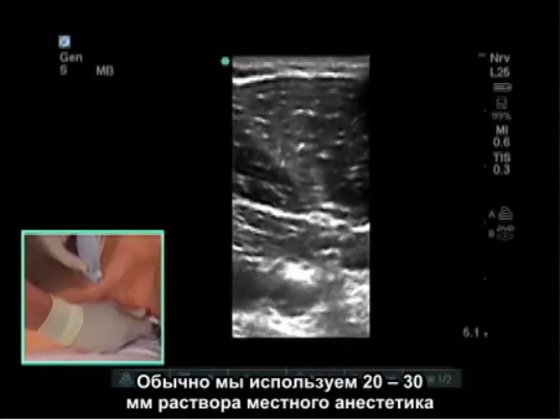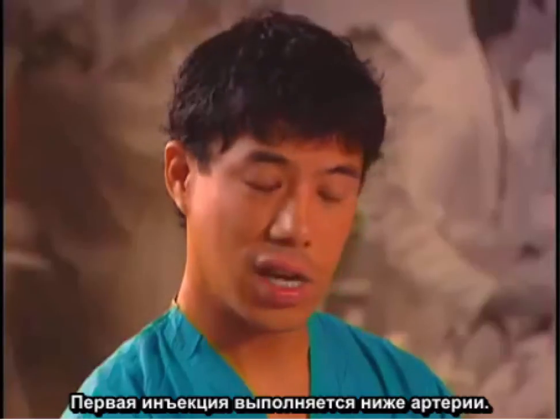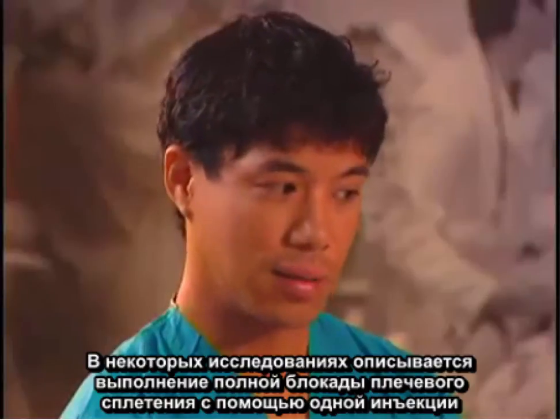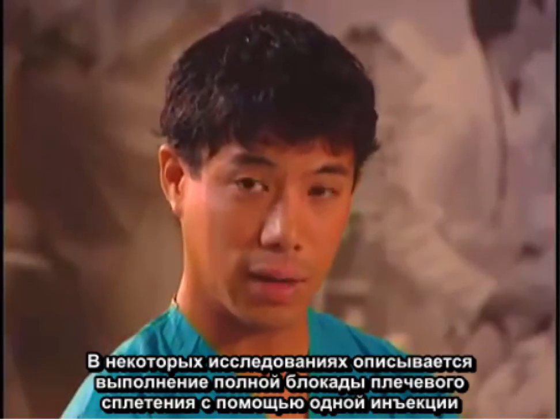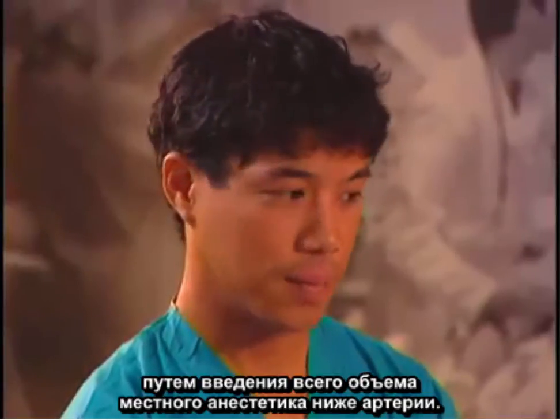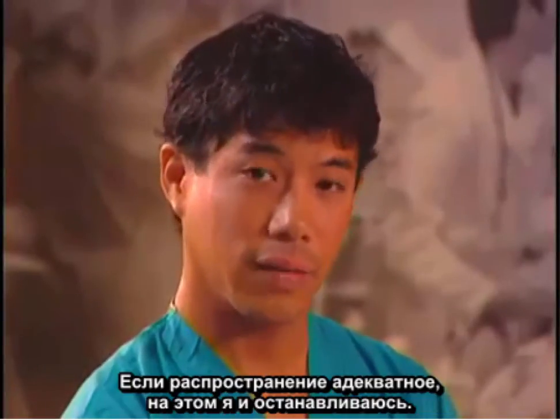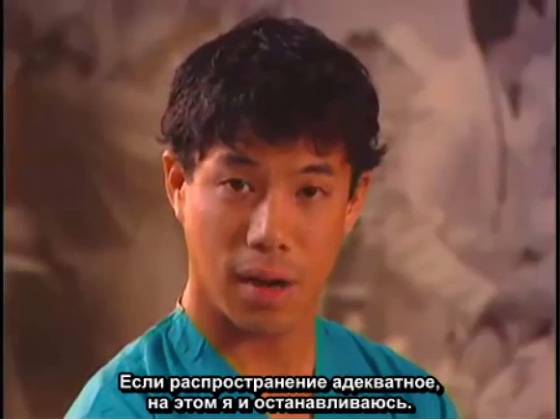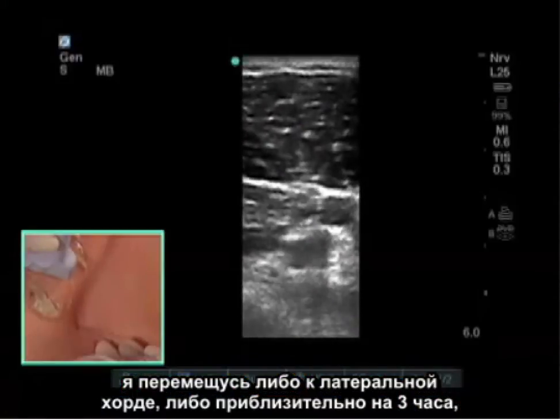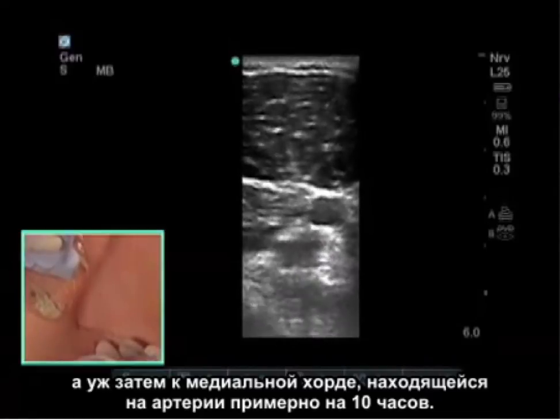Typically we use about 20 to 30 milliliters of local anesthetic for the infraclavicular block. Our first injection will be below the artery. Some studies have described a single injection depositing the entire local anesthetic below the artery resulting in a complete brachial plexus block. Usually I do my first injection below the artery and look at the spread. If the spread is adequate, I'll stop there. If I need to reposition, I'll go to the lateral cord at approximately 3 o'clock and then to the medial cord at about 10 o'clock on the artery.